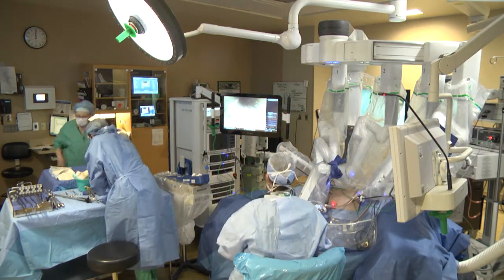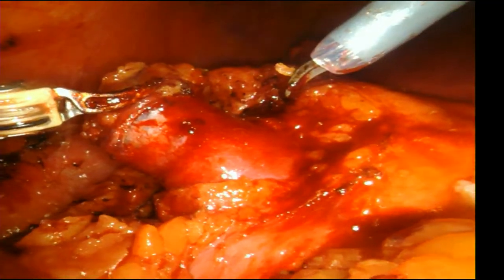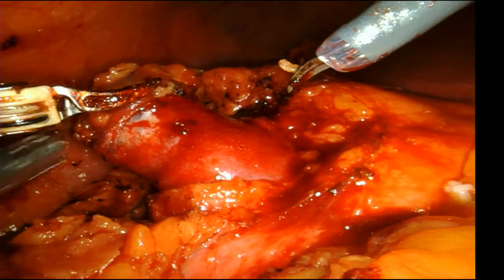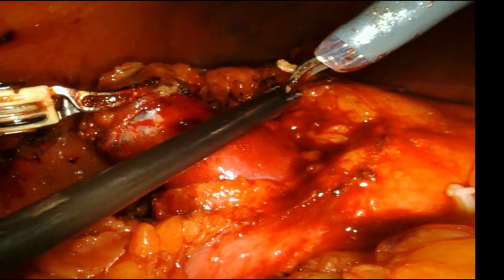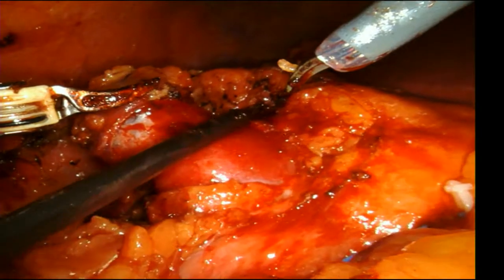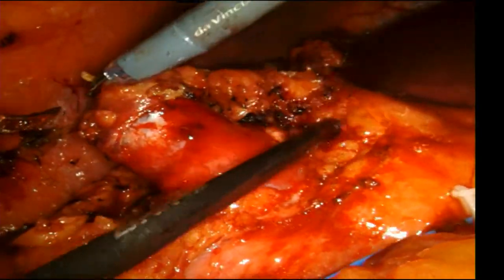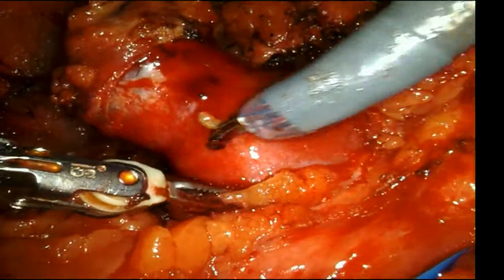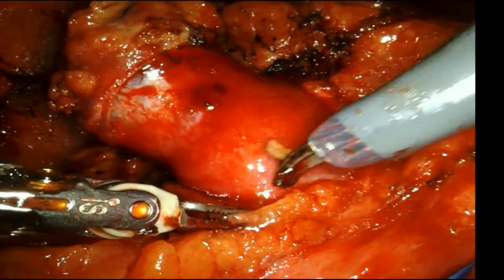All right, so here's where the egg shape of the tumor is going to give us a little bit of challenge. We're going to have to figure out our strategy here, because although you see there's a big exophytic component sticking out of the kidney, there's just as big a component that's going into the kidney and is actually going all the way down to the sinus. As I showed on that one cut I gave you, it actually goes all the way down to the sinus fat. So it's really only 50-50 exophytic. There's this much inside the kidney as well. So we're going to try to figure out with the ultrasound where we need to cut to get this out. We may end up having to cut clear down to here to get our margin.